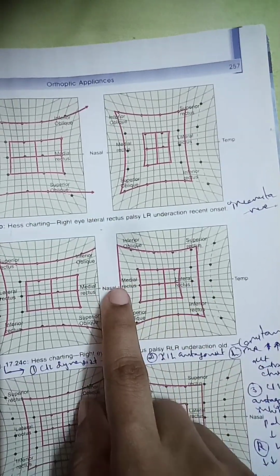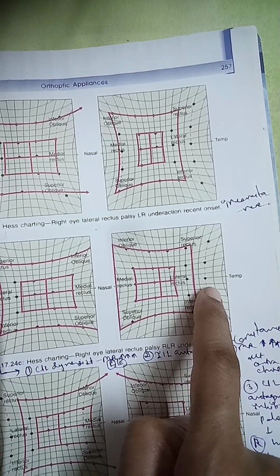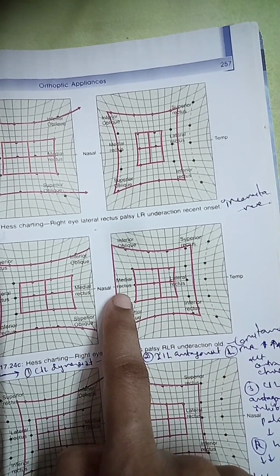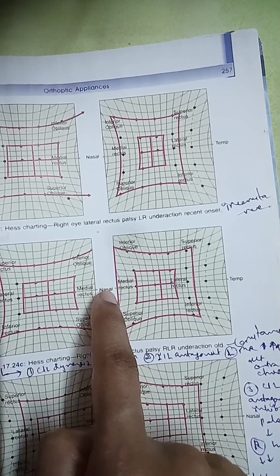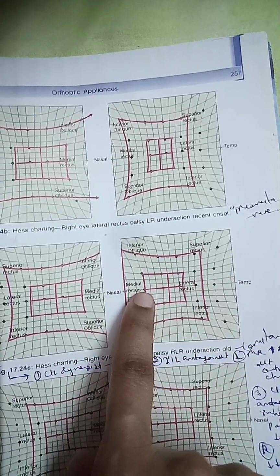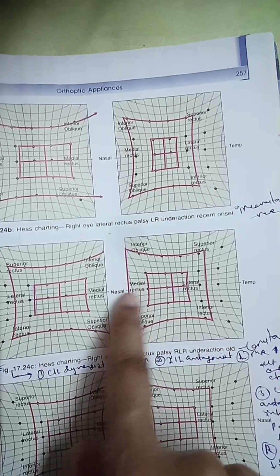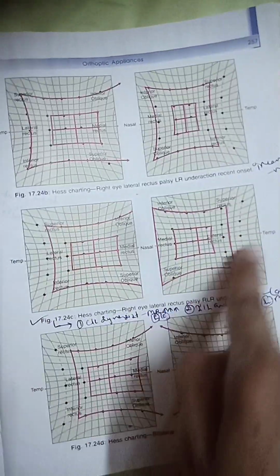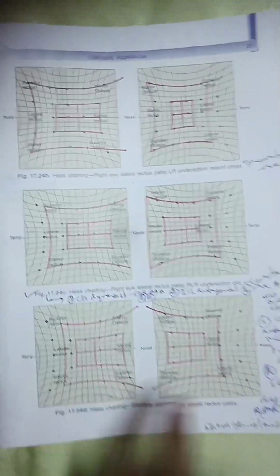You will see the ipsilateral antagonist of this muscle. Right lateral rectus ipsilateral antagonist is medial rectus. And why is it overacting? It should stop here, but it's overacting here. Why is it overacting? It's because of the contracture of the ipsilateral antagonist. Contracture of this muscle happens, and that's why it's overacting. So this is how the comitance spreads in the late phase of the paralytic squint.